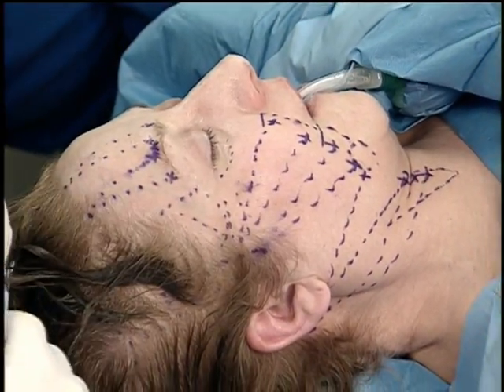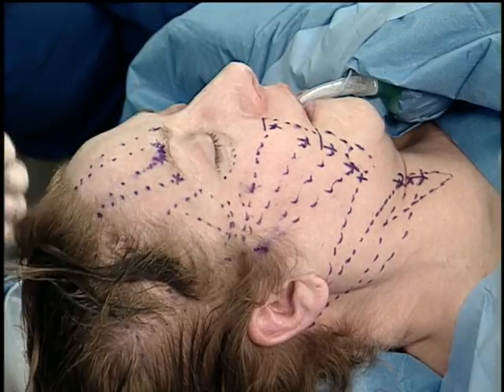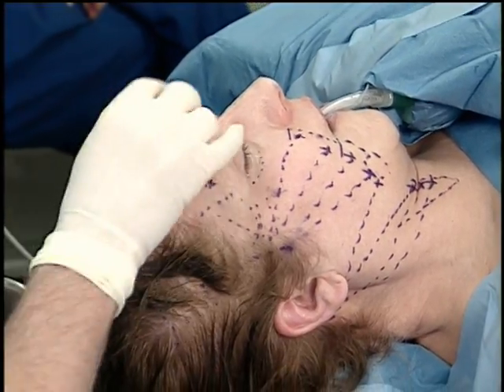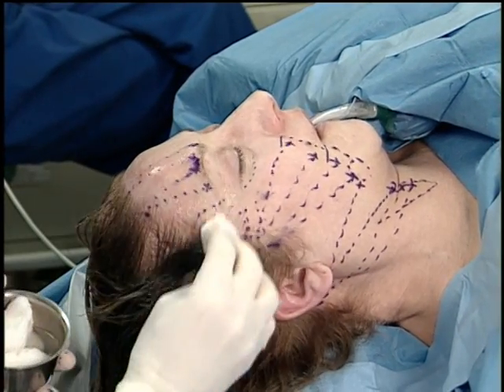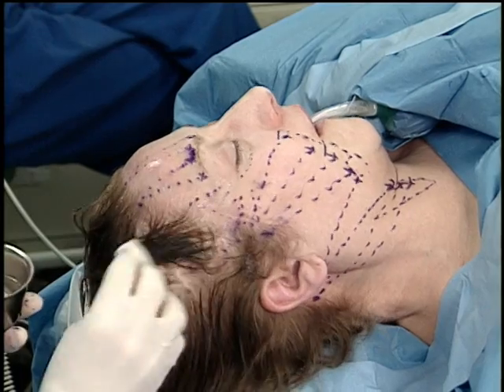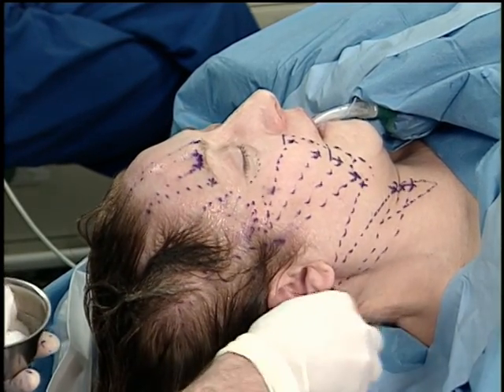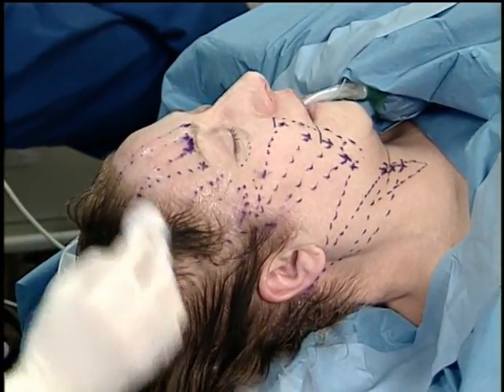Now that we have the patient marked, we're going to do a simple prep. I use a chlorhexidine type solution, non-betadine, as I don't like to stain the tissues. And once the patient is marked, I just get their hair nice and wet. We already have some cream rinse in the hair. And this is a sterile technique when it comes to managing the scalp, a sterile clean technique.